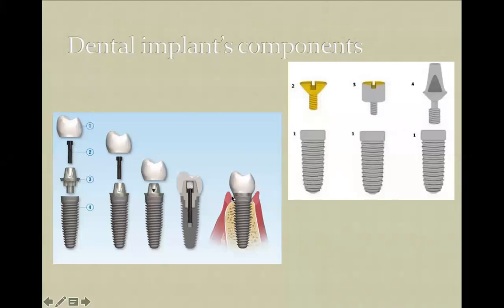But before placing the abutment, we have to pass through several surgical steps. And here, on the first surgical step, we're using a covering screw that will cover the internal threads in order to prevent any soft or hard tissue from growing inside the dental implant.